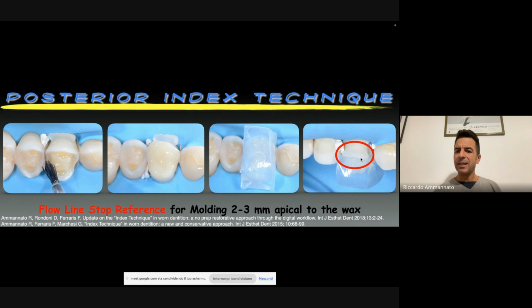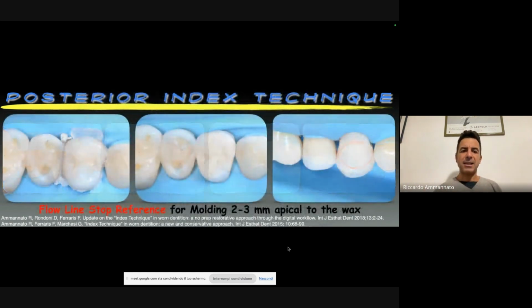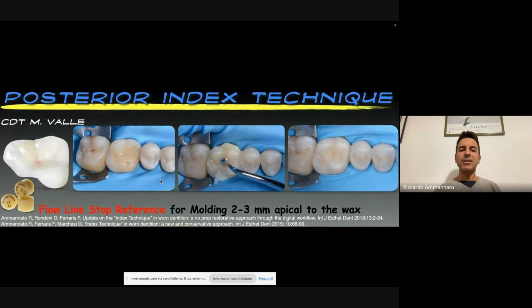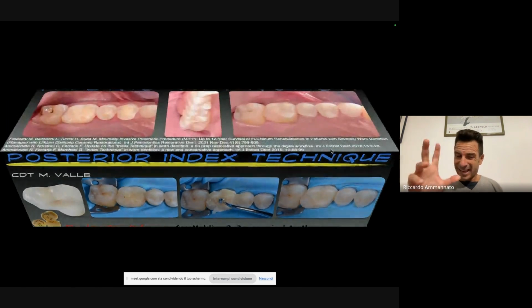I will check if the key is kissing my flow. I will remove the excess that is in the interproximal area with a probe, and then I will cure. And this is after opening my matrices and after doing the finishing procedures. And then, as you see here, we have done the 2 premolars and the second molar, and then I'm going to cement my glass ceramic only on the first molar, which is one of my table legs, okay?